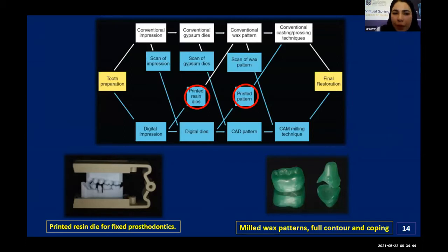Okay, up to now, I talked about conventional workflow, which is defined on the upper line of the chart, and digital workflow, which is defined in the lower line of the chart. But some combinations of digital and conventional workflow may be used.